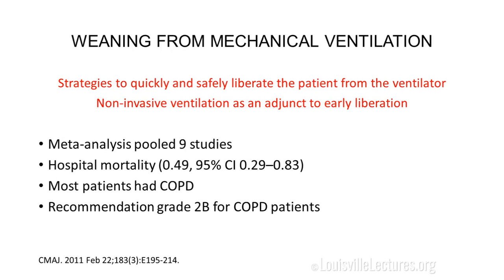Also, I think it's important to realize that when you're going to use that strategy, it means extubating the patient and putting the patient on non-invasive ventilation right away. You don't wait until the patient starts getting tired after you extubate to initiate non-invasive ventilation, because I see that as a common mistake. That's not how the studies did it, okay? So if you're going to use that strategy, you're going to put the patient on non-invasive ventilation right after you extubate the patient.